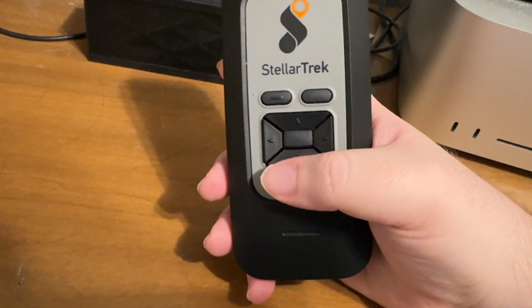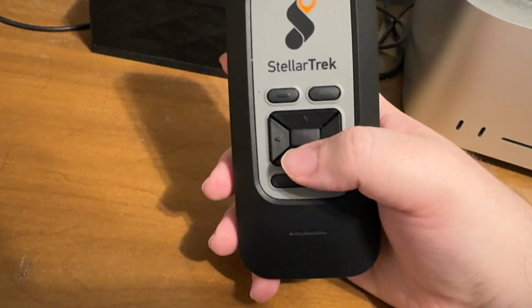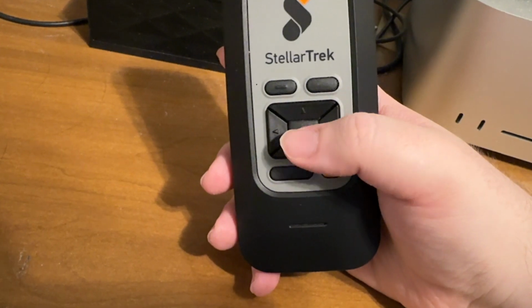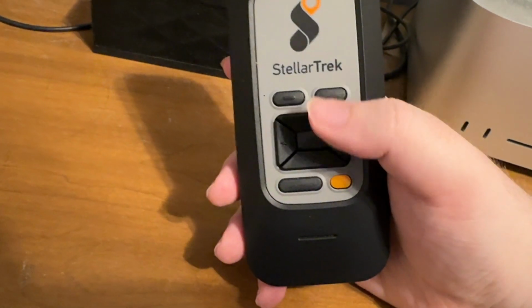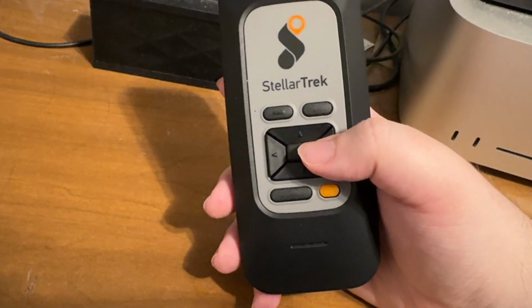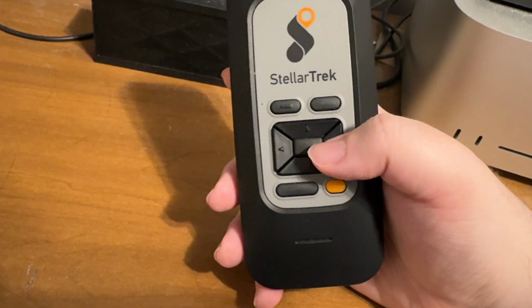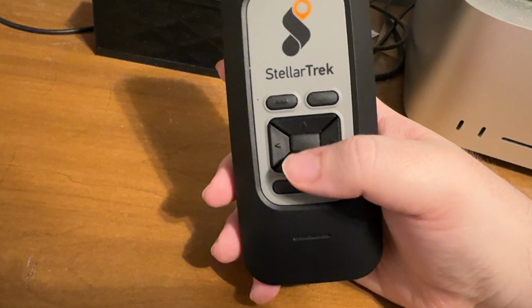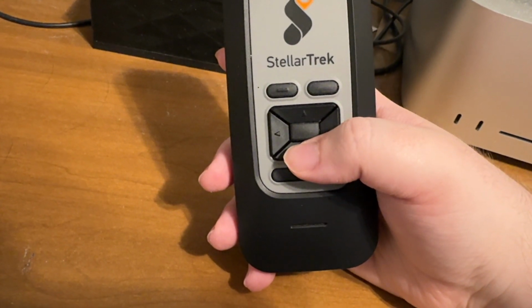So we can also rename this landmark. So currently it just exists as an address. So to rename it, I'm going to go back into the landmark selection with go to. Select a landmark as your destination. 6 landmarks. Home sweet home. And press right arrow until we find the address. 687 Hancock Street, Massachusetts. And if I down arrow now, there's start in motorized mode, which we previously saw.